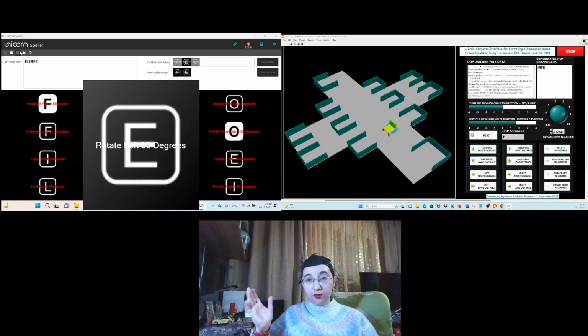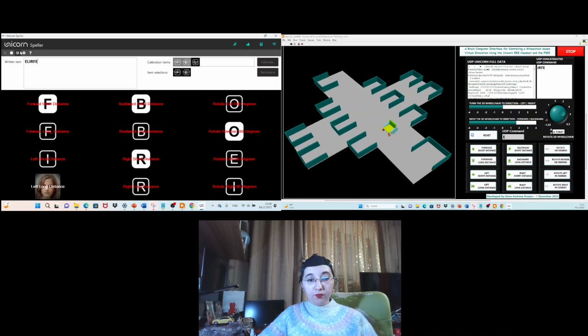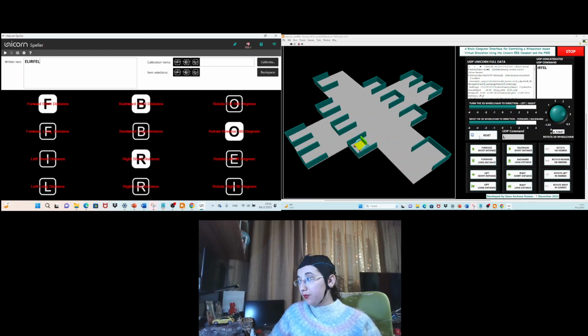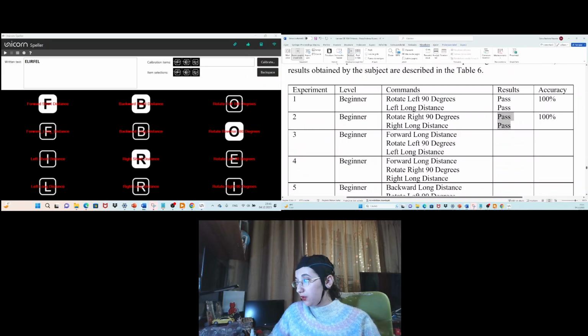Nice. You can see the rotating of the wheelchair. Really nice. You can see the wheelchair reached its destination. Reset, and here are the results. 3 pass results. And also the 100% accuracy.